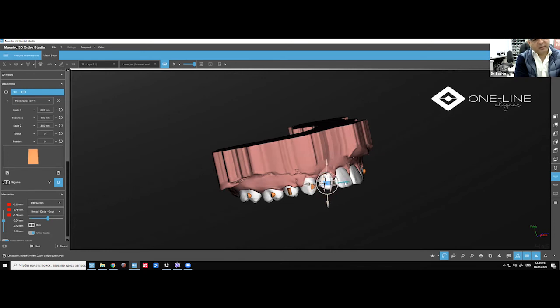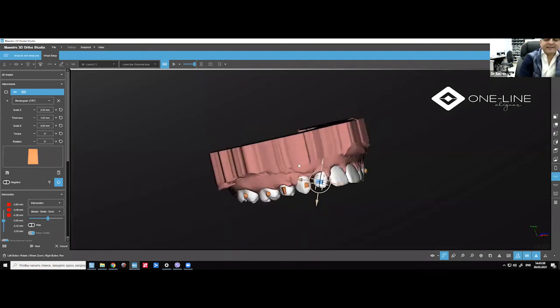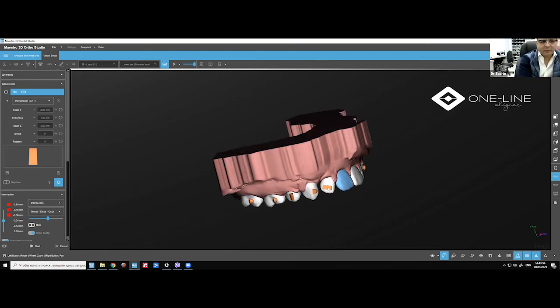You need to place it according to the axis of the tooth. This is actually a horizontal attachment, similar to Jonathan Nichols' design which he came up with. The only difference is that you can make it a little bigger. You have to be as down as possible.